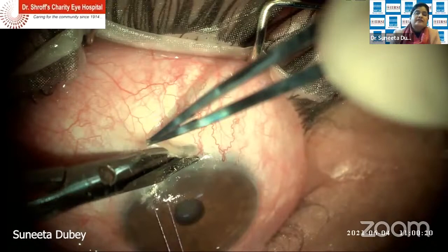No one is using superior rectus suture? Sunita used lots in the past. The point to emphasize is that if you use a superior rectus suture, use a round body needle and not a cutting needle, which is what people normally use. Otherwise the cutting needle tears the conjunctiva and there's leakage, because we are making the bleb right behind, going quite behind. So one can use superior rectus also, but there are chances it can tear the conjunctiva, or there can be hematoma also.